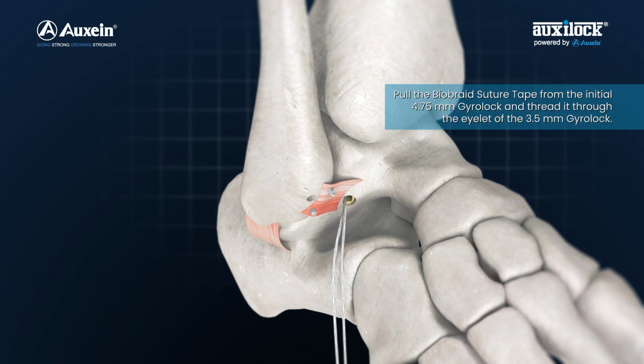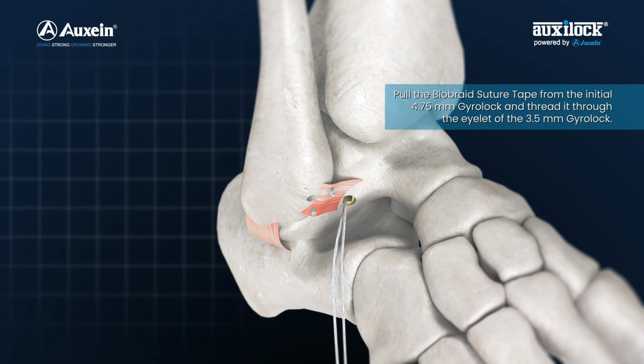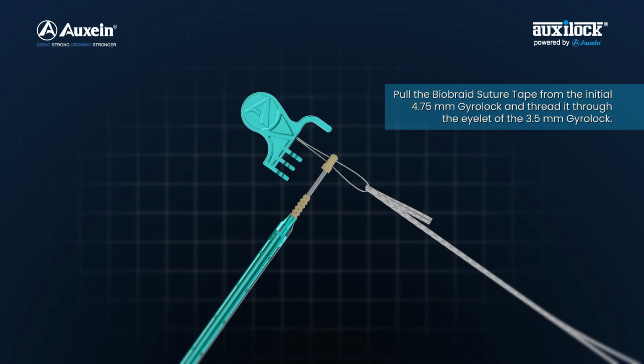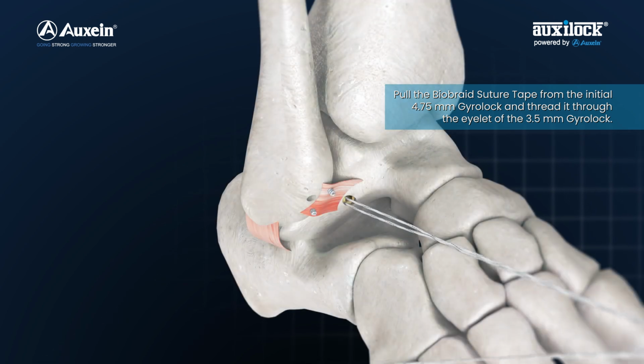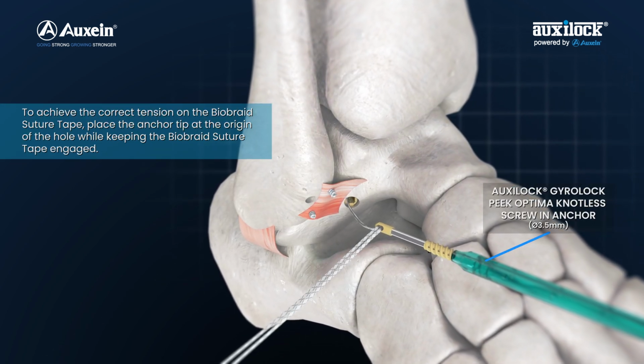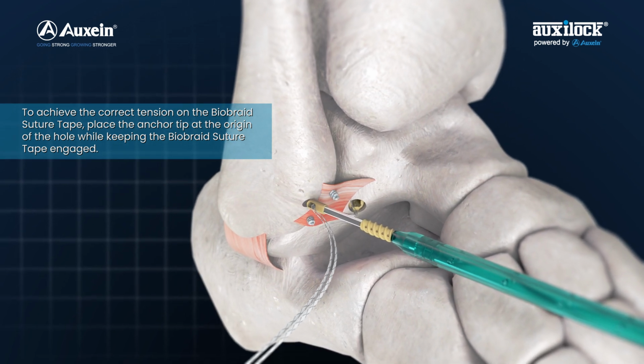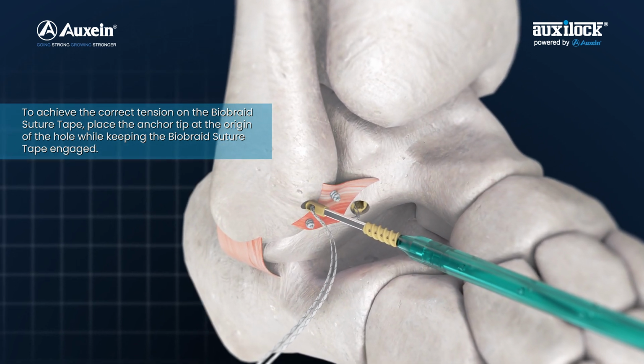Pull the BioBraid suture tape from the initial 4.75 mm gyrolock and thread it through the eyelet of the 3.5 mm gyrolock. To achieve the correct tension on the BioBraid suture tape, place the anchor tip at the origin of the hole while keeping the BioBraid suture tape engaged.